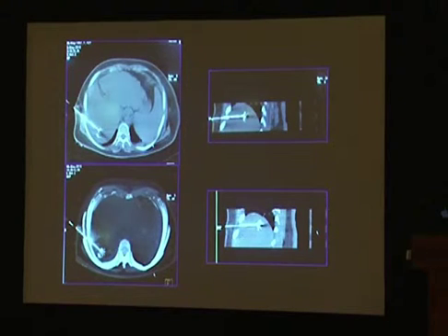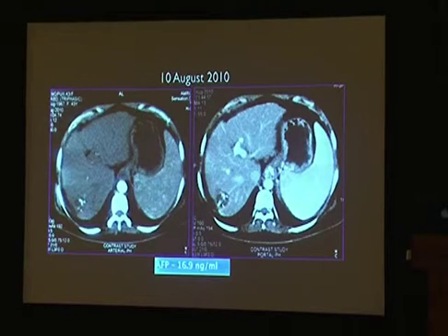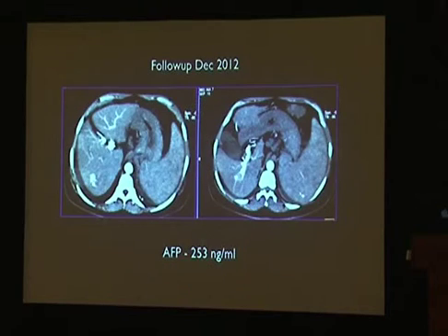In the lesion, this is a sagittal projection of the same patient. On follow-up of this patient after 3 months, there's a good ablation out here. These bright specks are basically the lipiodol which we had initially put in during transarterial chemoembolization, and you can see the alpha-fetoprotein level has come down significantly. But unfortunately, 2.5 years later, which is usually the story, there was a recurrence again at the same site, but this time it was a lot more aggressive and also had a thrombus in the portal vein, and the alpha-fetoprotein is also rising.